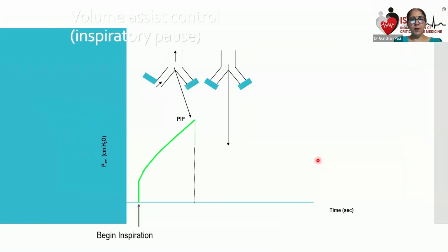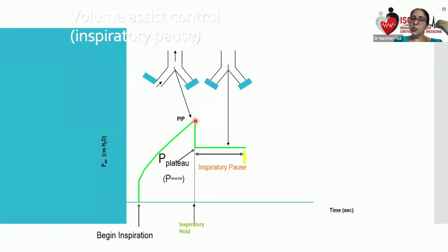So this is the graphic representation. See here, the inspiratory valve is open, gases are going to the patient. So the flow is going, so pressures will rise. When both these valves close down, this is the inspiratory pause, this is the pressure. Sometimes we see peak pressure increased. This pressure is increased if this tidal volume 380 is being blocked, so it means there is something which is blocking this tidal volume from going into the patient. So you need to check where the problem is.